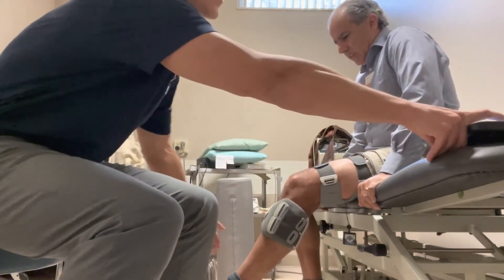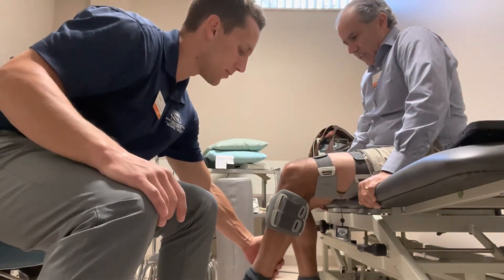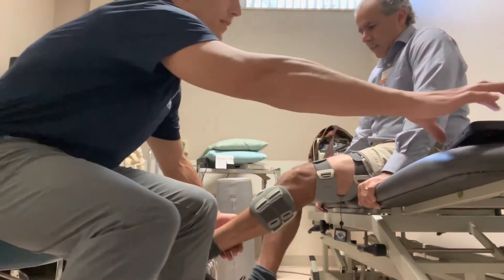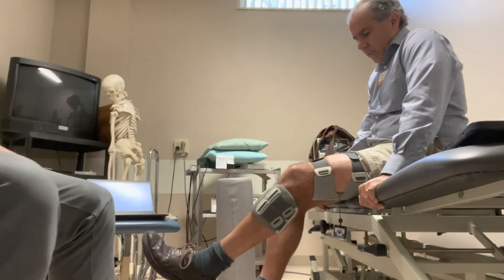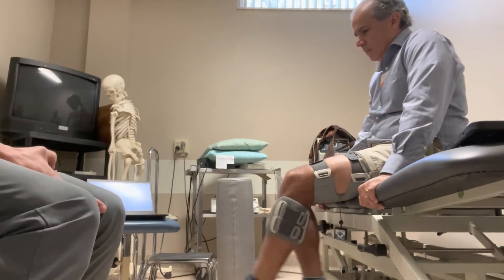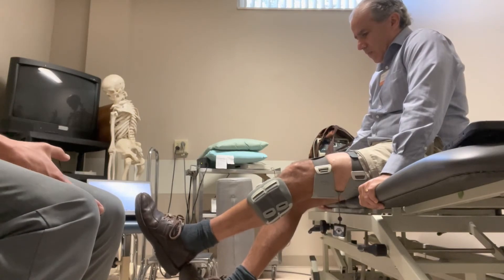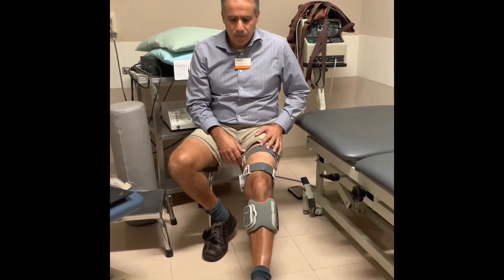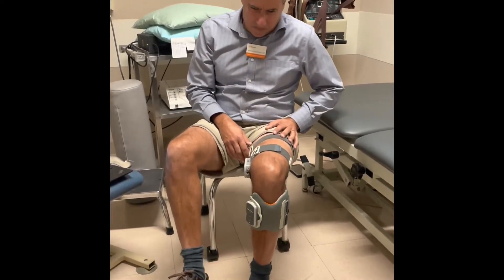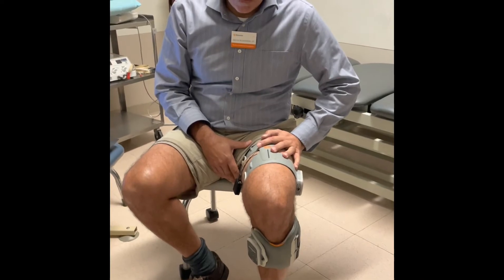Starting from a more extended position, we'll do knee flexion against manual resistance. You can do an isometric hold at the end, then slowly release, with the patient controlling that eccentric phase. An idea for closed kinetic chain hamstring in sitting position is on a rolling stool — every time the stimulation comes on, that closed kinetic chain hamstring contraction. The opposite is closed kinetic chain knee extension on the stool.